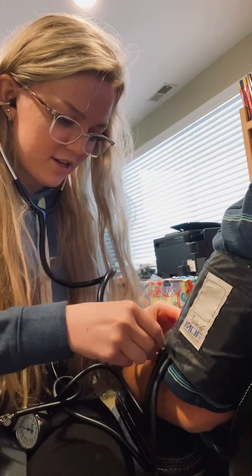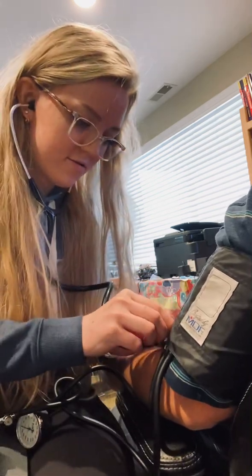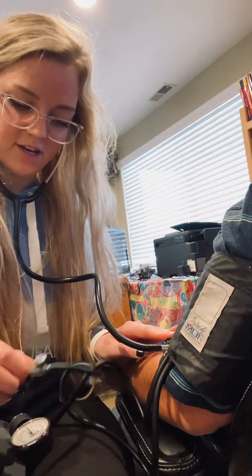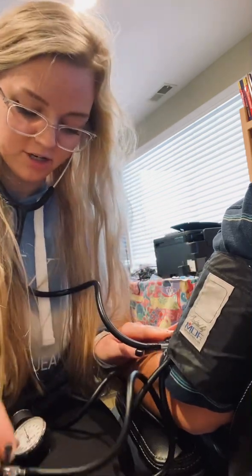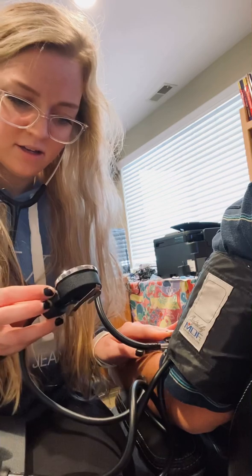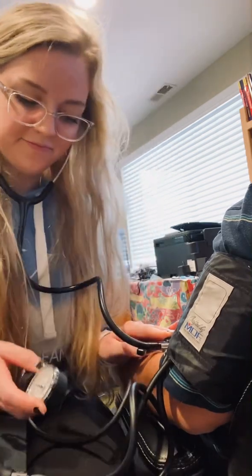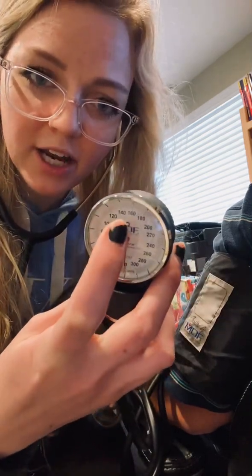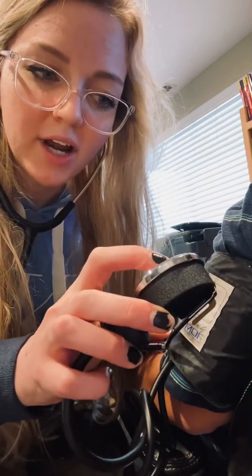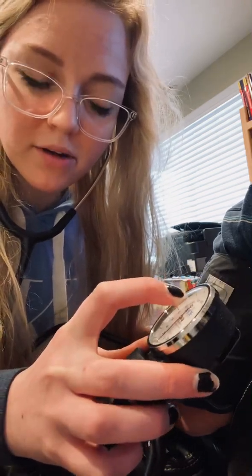So you just lay it on there. And then you want to make sure you turn this dial all the way to the right, because this is going to be how you blow up the blood pressure cuff. And then this is what you'll use to monitor the air being pumped in. So what you want to do is pump it up to 200 millimeters of mercury right here. And then when I pump it up, you'll just release it slowly. And then when you start to hear a thump, that'll be what you call the systolic blood pressure.